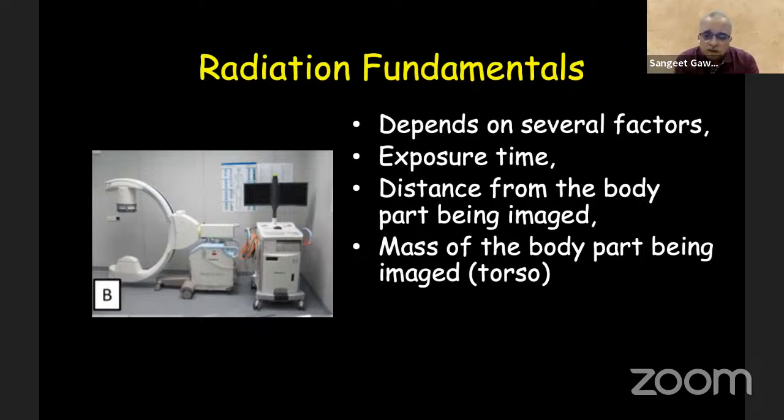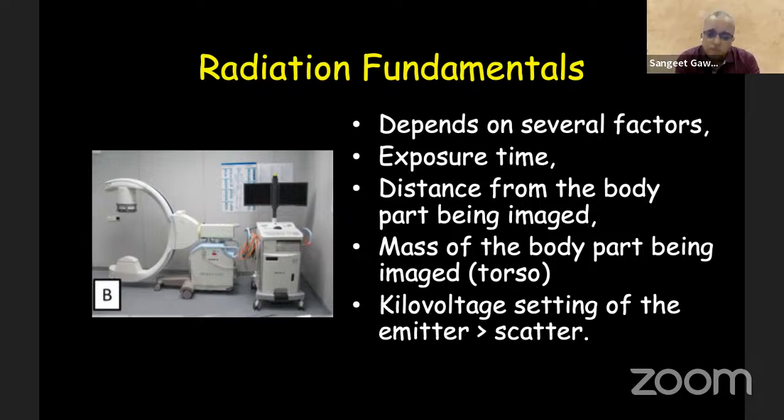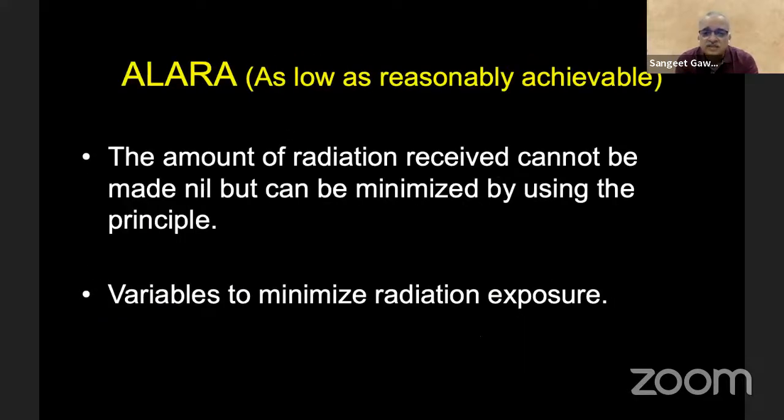If you are doing a spine or a pelvis or a hip, the exposure is much more when you are performing surgery around the torso. And proportionate is the kilovoltage which is emitted, that is indirectly more scattered radiation you are receiving. So the principle we must follow is ALARA, that is, as low as reasonably achievable radiation exposure you must practice. I'll come to these principles of ALARA in a subsequent slide.